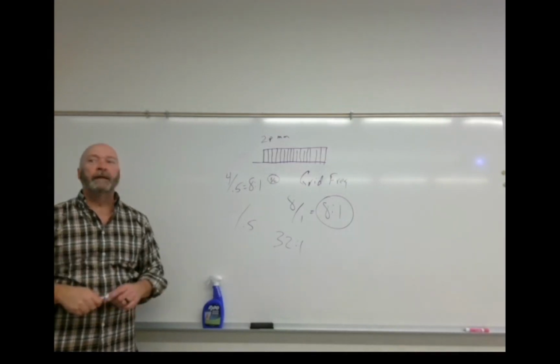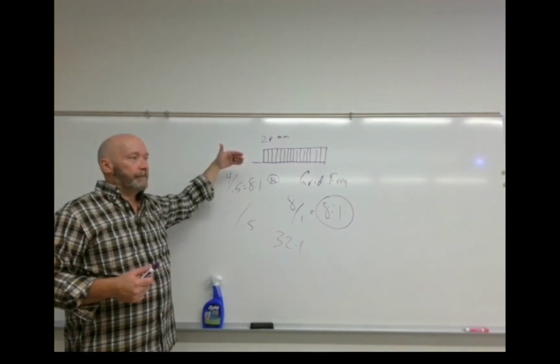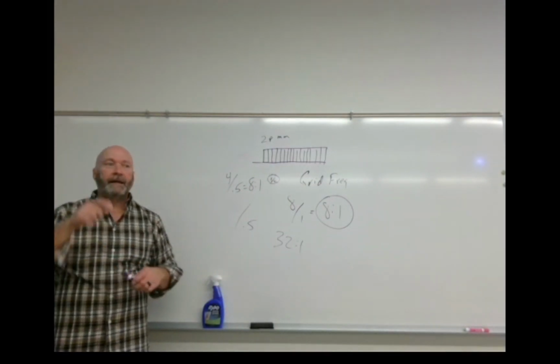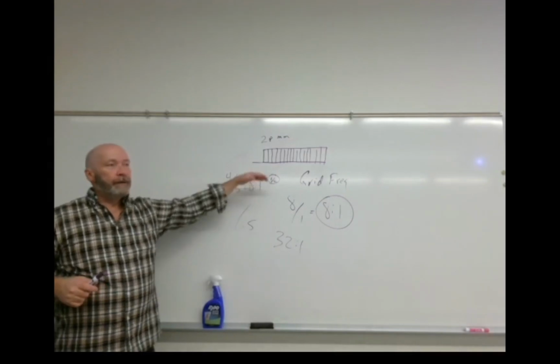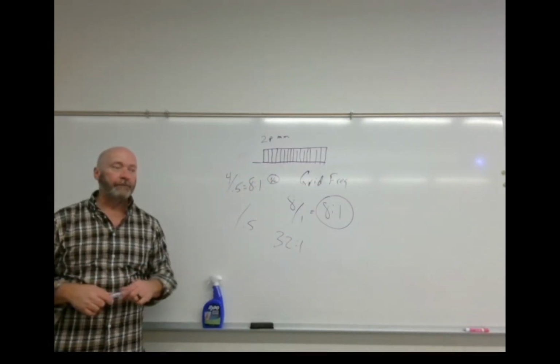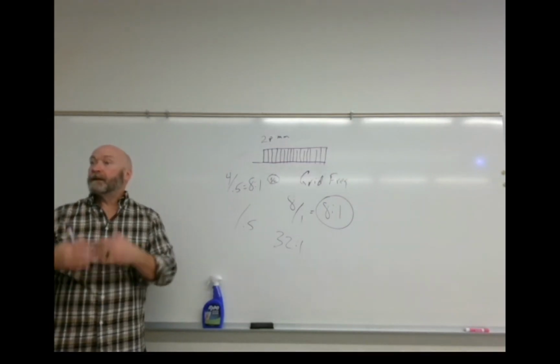Okay, so Moiré artifact. And we had a problem with Moiré artifact whenever we changed from screens and films to CR. The way the CR image is created is we make an exposure on an image receptor, and then it has to be scanned by laser light. The grid frequency we were using was too similar to that scan pattern, and what we wound up with is that aliasing artifact or Moiré artifact. The reason you get that on your phone is because the resolution on your computer and the resolution on your phone are too similar, and you get the same thing.